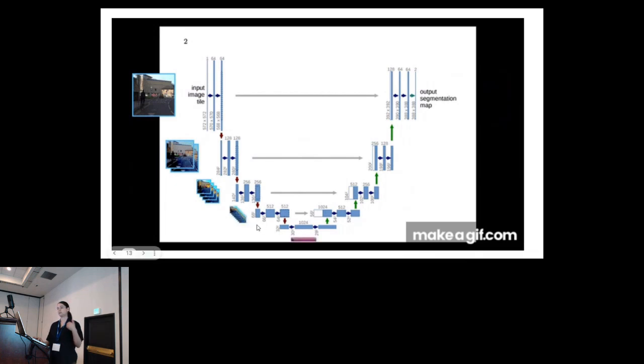So with every layer it starts to understand better what the image is, and this is our encoding part. After encoding, it builds back the masks that we get as an output from the segmentation.